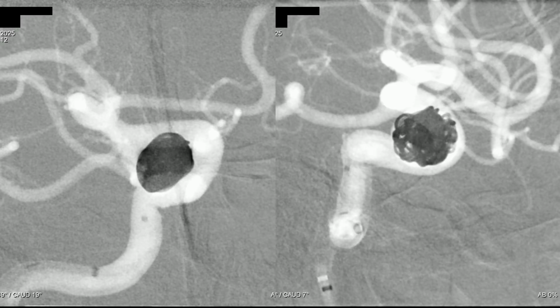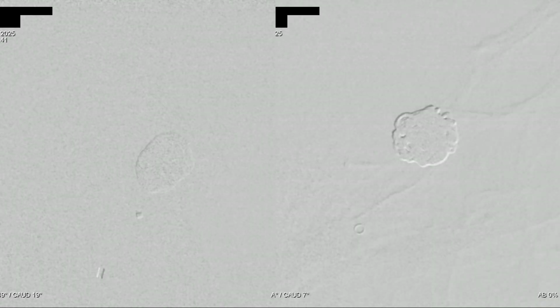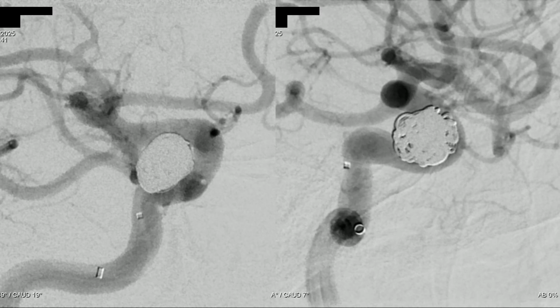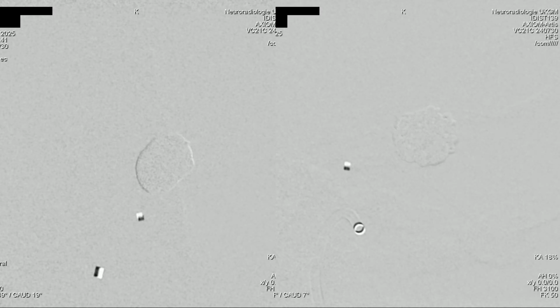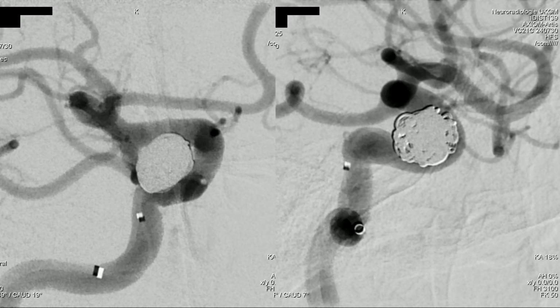We need a 2D angiogram, and as you can see, we have a dense coil package, but there is still a little bit of aneurysm rest, and that's why we will implant a flow diverter along the aneurysm neck.